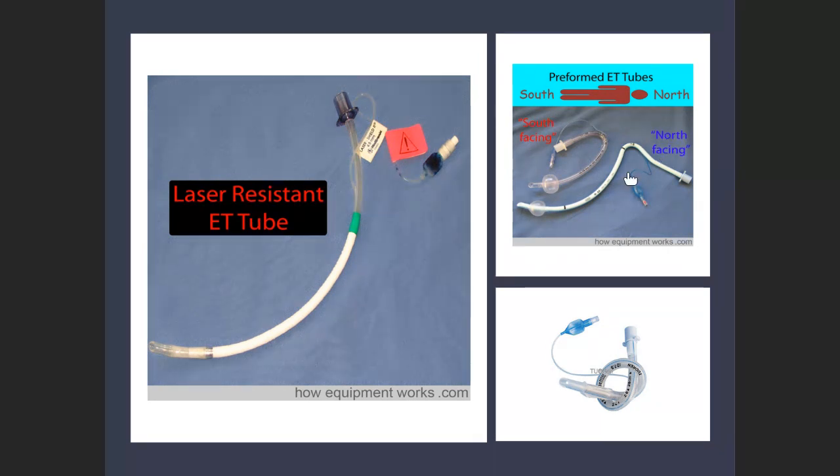So you're asking if you put in the laryngoscope, where would you place this tube? No, we would always place the tube in the larynx. That doesn't change. It's going to go in the larynx. But these tubes are preformed. I can't take that bend out of them. That's how they are made. So I'm asking you, if I were to put one of those tubes in, what direction would it point? How would it be in the body?